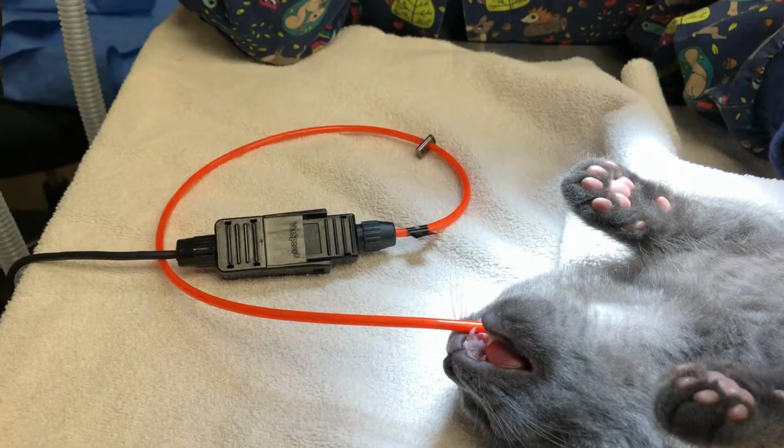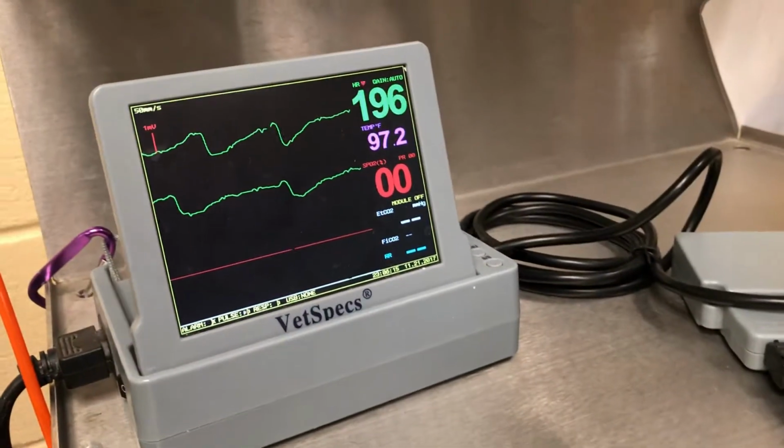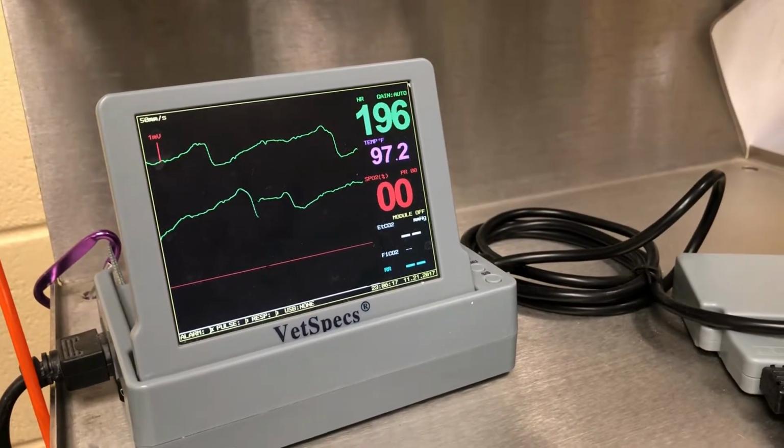My cat in my video is a little high. You can see that she, with her stethoscope in, the machine was reading it at around 196 beats per minute. And as far as using this machine, we lube it up and then we place it into the esophagus down to the level of the 5th rib.